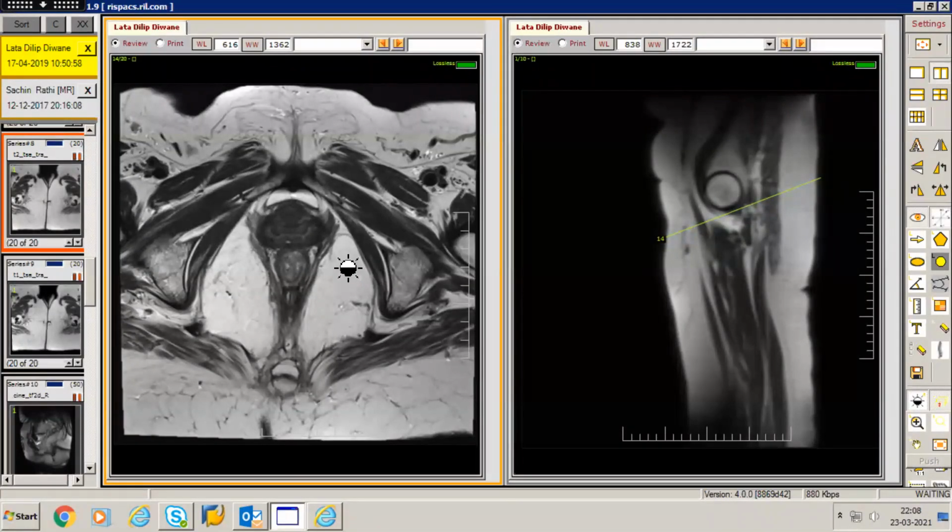Now, when you have a grade 1 endopelvic fascial injury, though it's not there in this case, the first sign would be that the posterior edge of the H will start sagging posteriorly. When you get that so-called sagging, kind of symmetrical, you can see that lovely convex bulge. But as soon as this tends to form a horn or a tip behind the posterior wall, that's usually the first sign that the patient has had an endopelvic fascial injury or a type 1 defect.